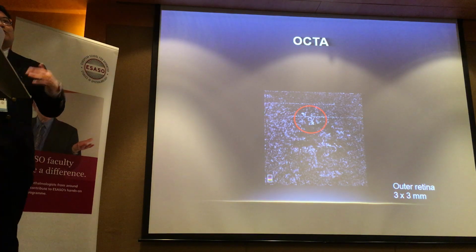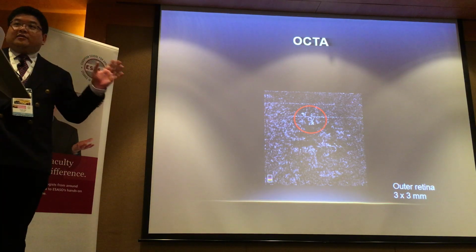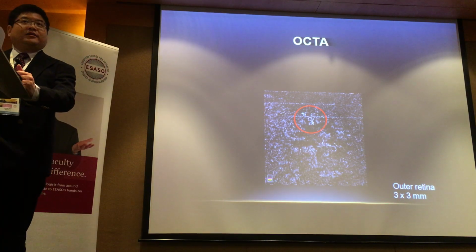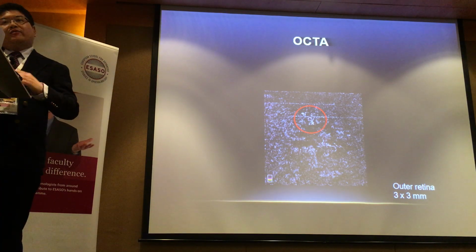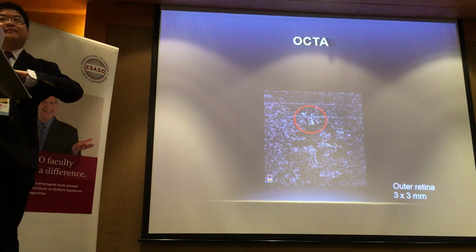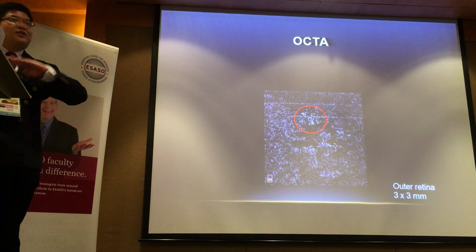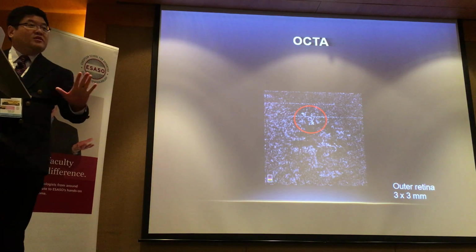What if I drew a line from the floor to the ceiling, and you could count how many people there are in the room? Then you'll know it's obviously a very good turnout. But what if I drew the boundaries from the ceiling to here? Then maybe you'll count myself and a few people who are standing, right? All of you will be below that layer, and you'll be missed.